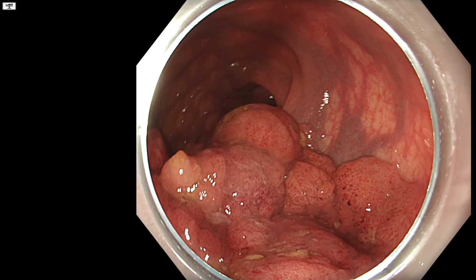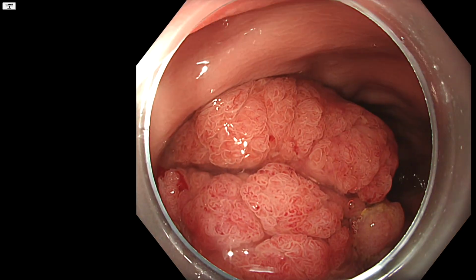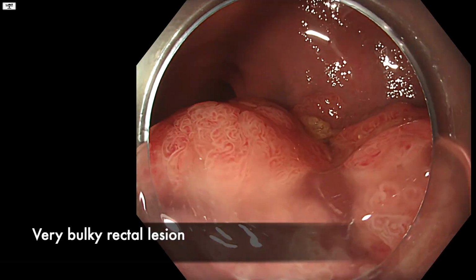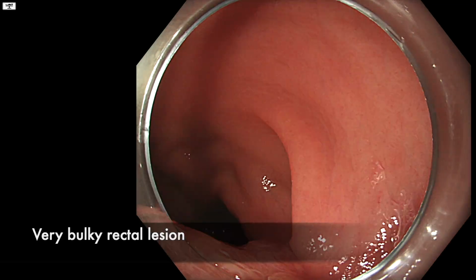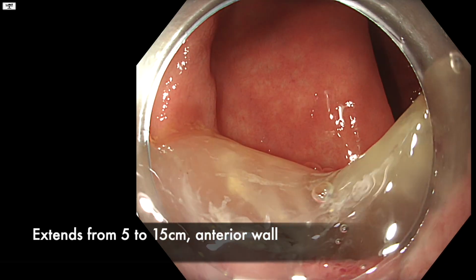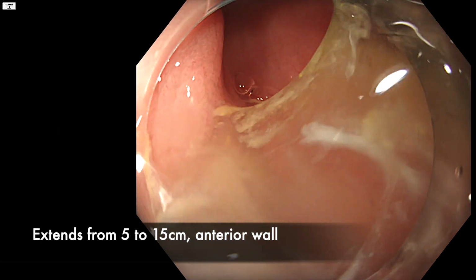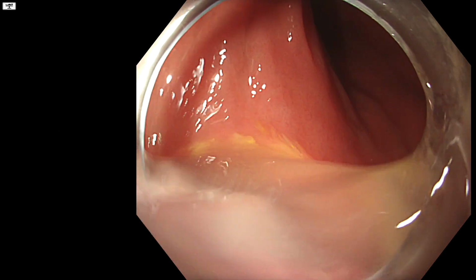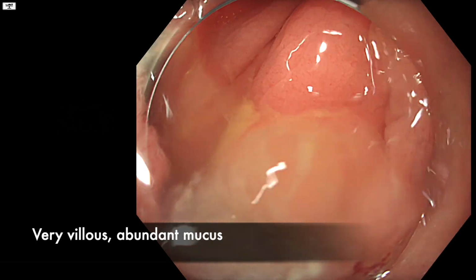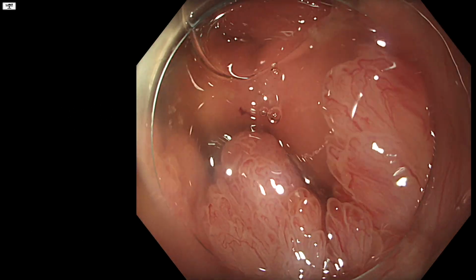So this is the lesion you're seeing on screen. It's a very bulky 10 centimeter mixed nodular LST, which was sitting in the mid and upper anterior rectum, so roughly from 5 to 15 centimeters from the anal verge. So a good portion is above the peritoneal reflection. You have to bear that in mind. And as you can see, it's got a very villous surface which is coated in mucus, and this actually makes optical diagnosis quite difficult sometimes.